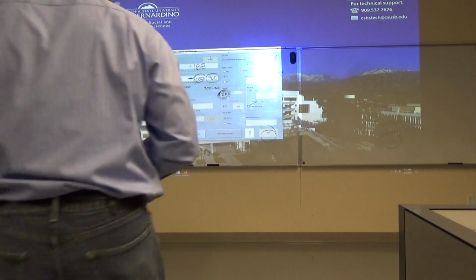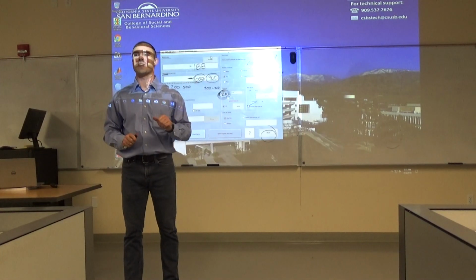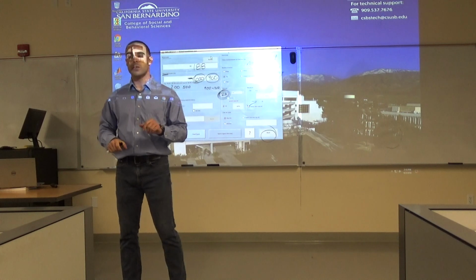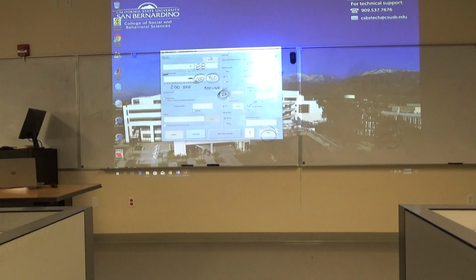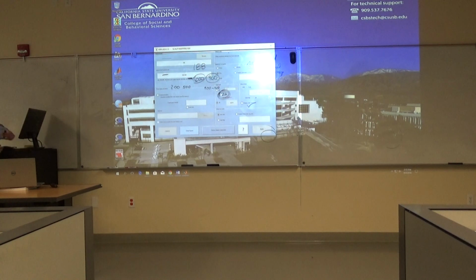Okay. How many of you want to do the three-dimensional head? All right. I promise you there's going to be an error message along the way because it happens every time. But we know how to fix it. Okay, so if you want to make the three-dimensional head, that's fine. Here's what we're going to do. Hold on, let me erase this.